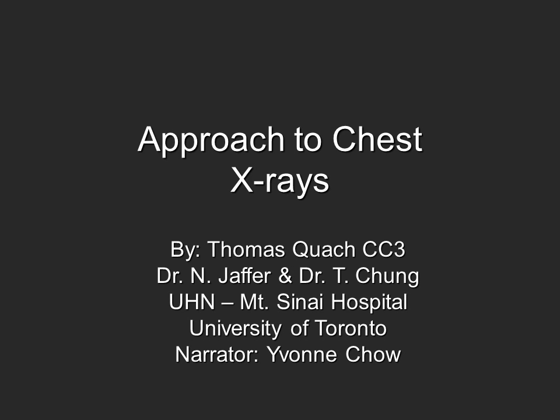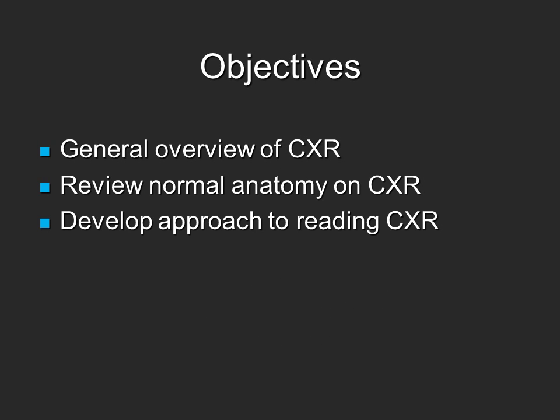Approach to Chest X-rays by Thomas Quash under supervision by Dr. Jaffer and Dr. Chung. The objectives of this presentation are to provide a general overview of chest X-rays, to review the normal thoracic anatomy on chest X-rays, and to develop a methodical approach for reading chest X-rays.